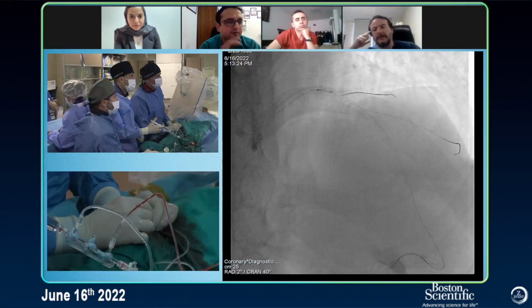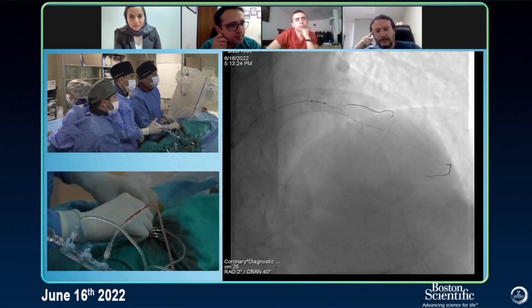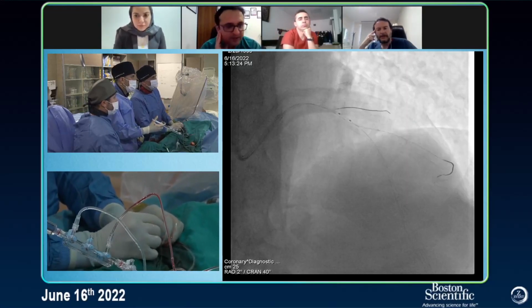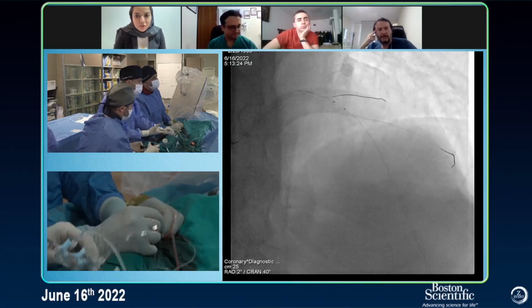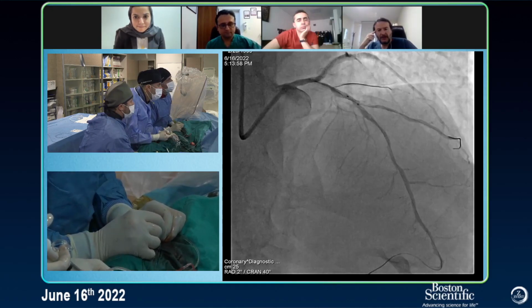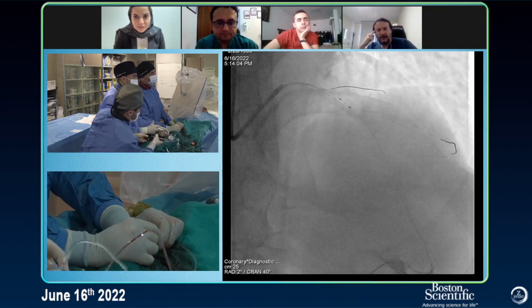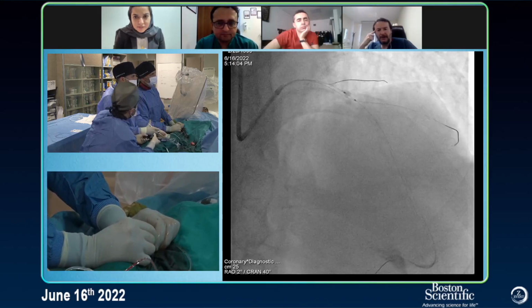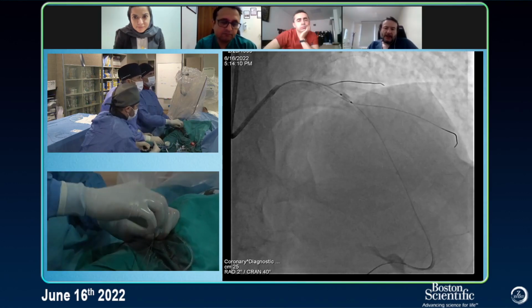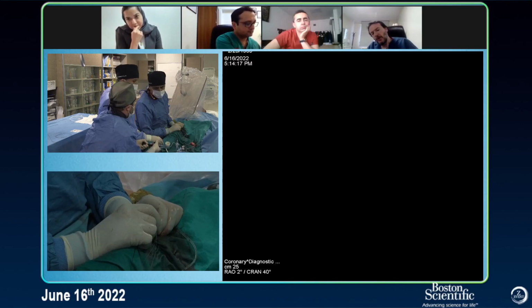And also in terms of sizing your cutting balloon, you knew the vessel size was around 4, so 0.5 smaller will prevent any major dissection. Yes, great sizing. Maybe it's still a wire LAD one here. Okay, go up here. We have to do something for the struts. Go up to 10. We have a wire there, and we are at 10. You can go also 12.